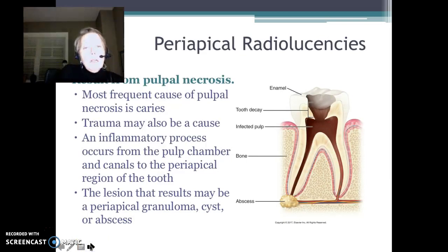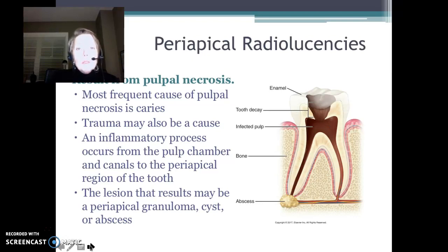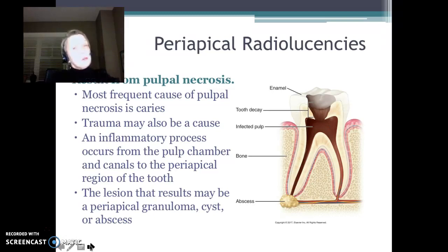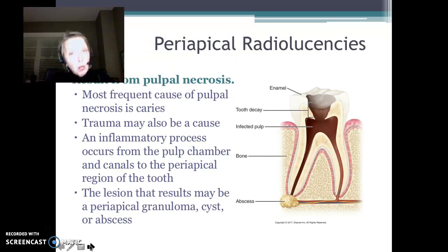Resulting from pulpal necrosis and pulpal death, we are going to see some periapical radiolucencies. The most common cause of pulpal death — the nerve dying — is decay. But trauma can also be a cause. By trauma, I don't necessarily mean getting hit, but hitting the tooth — occlusion that's too high for too long is traumatizing to that pulp.